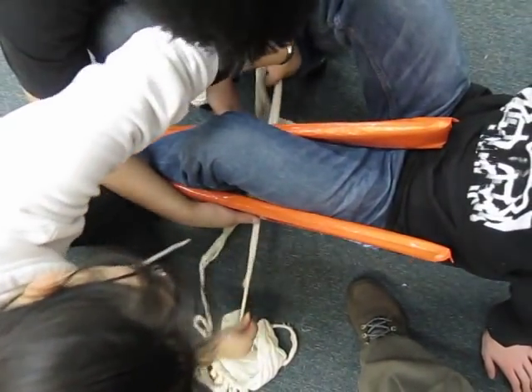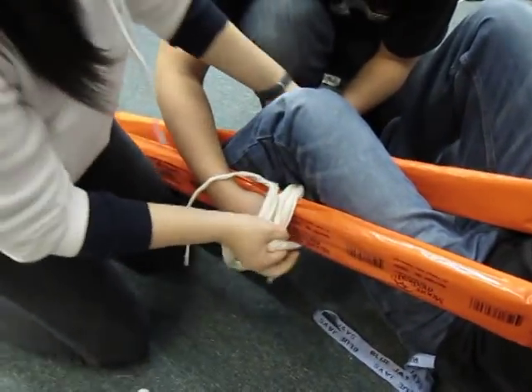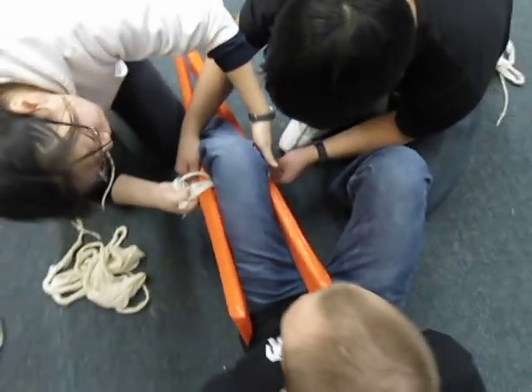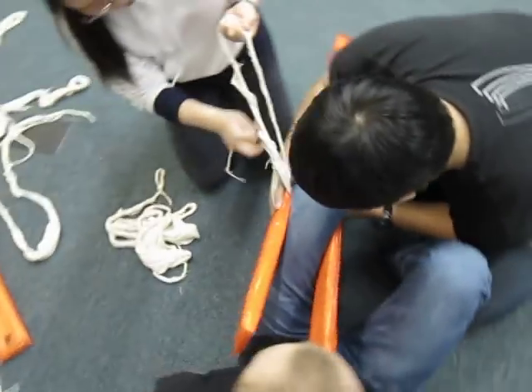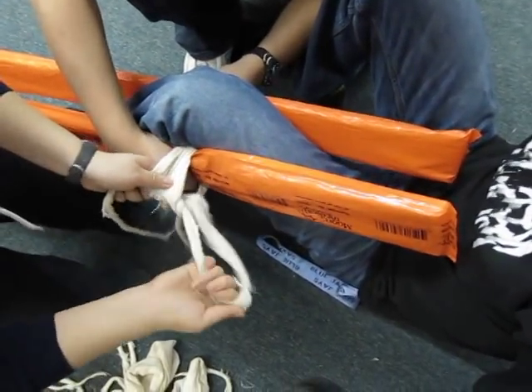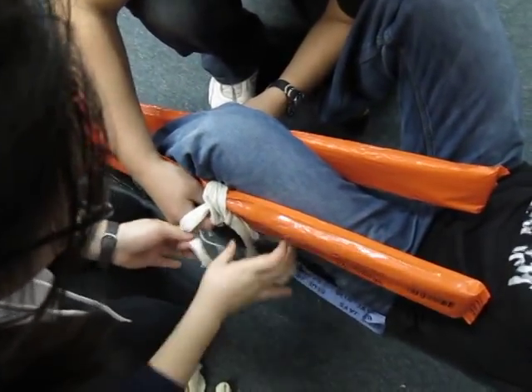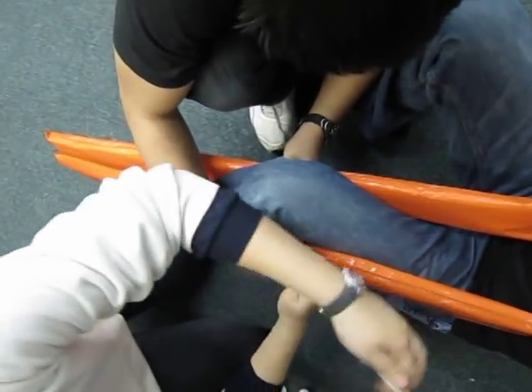You don't need pressure. You want to shoot it? Okay, now you want to shift him up. So you want this as flush as possible. And then you want to squeeze his leg — there's no tomorrow. And don't worry, because the injury is here, so it's not going to hurt him if you do this. Like you're barely even touching my knee. All of them, just push as hard as you can. So all the pressure's around the knee.